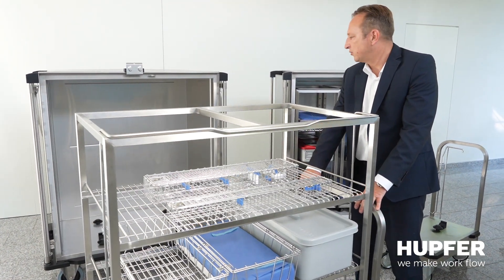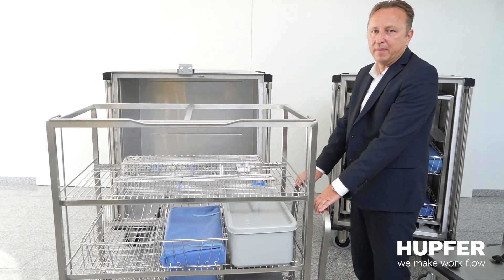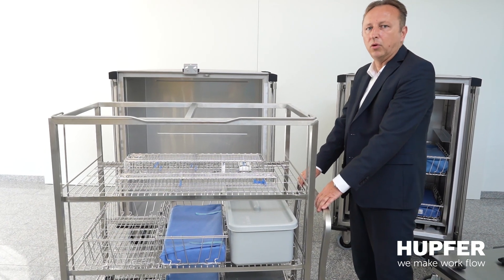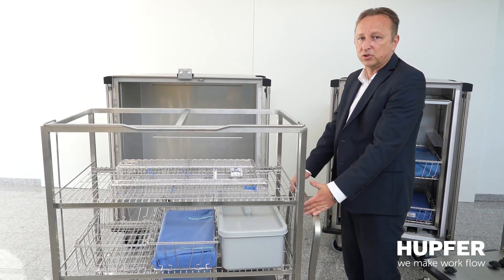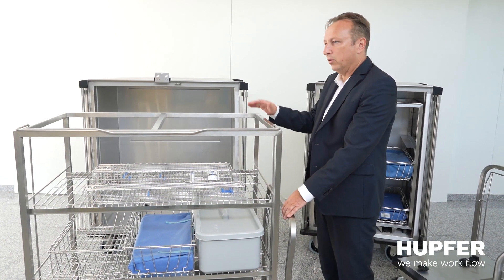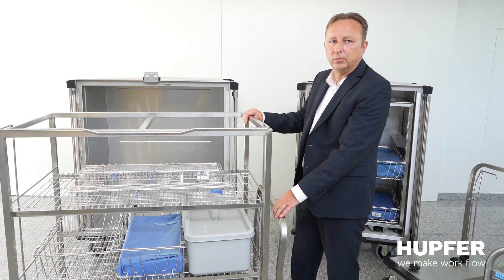The same process applies during transportation back to the CSSD area. The general question is what components make sense for you — and for that reason we encourage you to contact HUPFORM. We have hundreds of systems in Germany and abroad, with many references as a distribution system or in connection with a sterilizer, so the push-in rack can go through the sterilizers, meaning you only handle items one time.